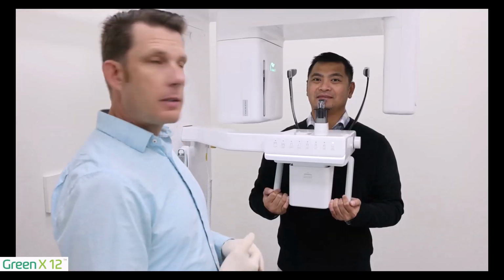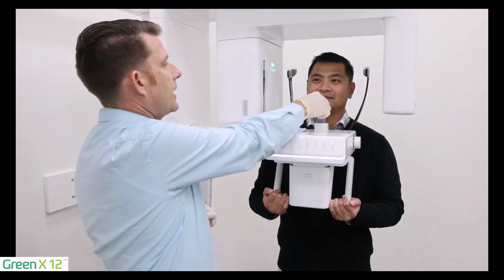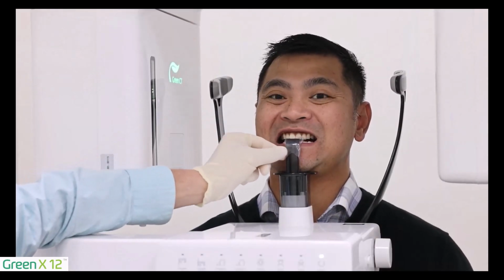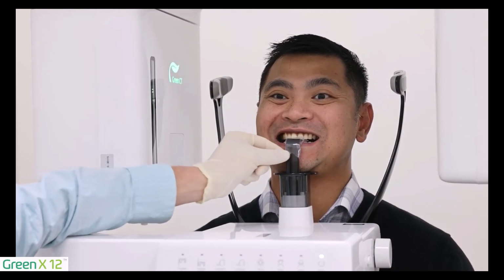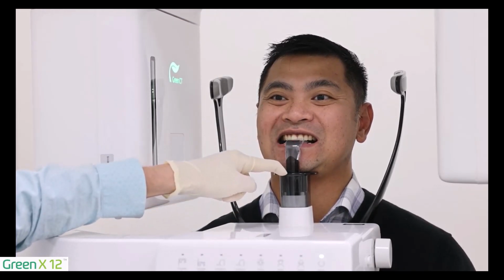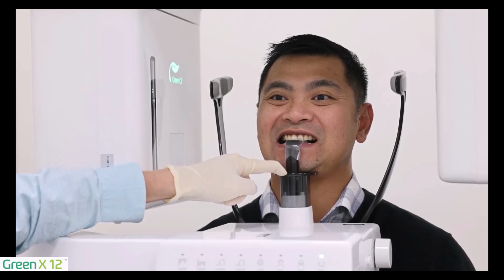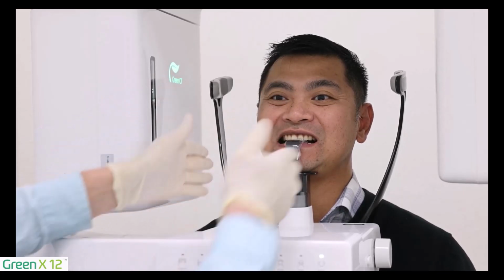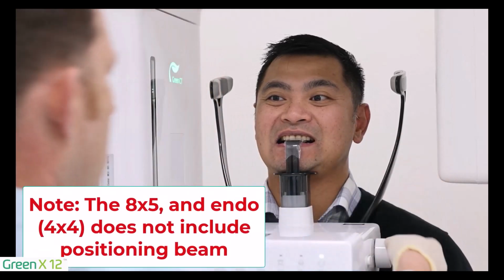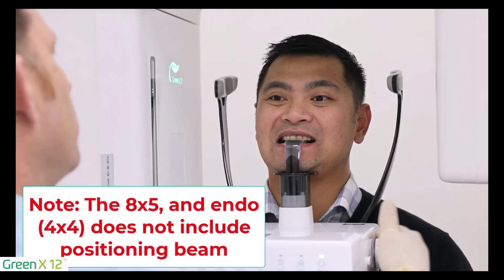So I have my patient positioned. I'm going to go ahead and have the bite on the bite stick. So I have my patient in the machine. I can see they're in the bite stick groove. I'm going to push down to ensure their chin is firmly on the chin rest. Next, I want to make sure they're lined up center. So I'm going to make sure they're lined up center here. Go ahead and close my temple supports.